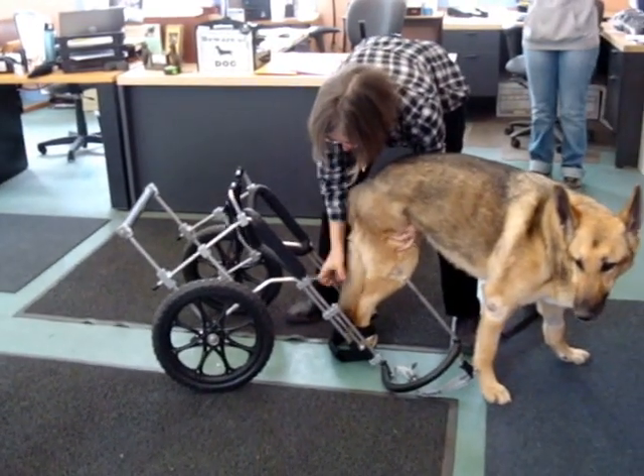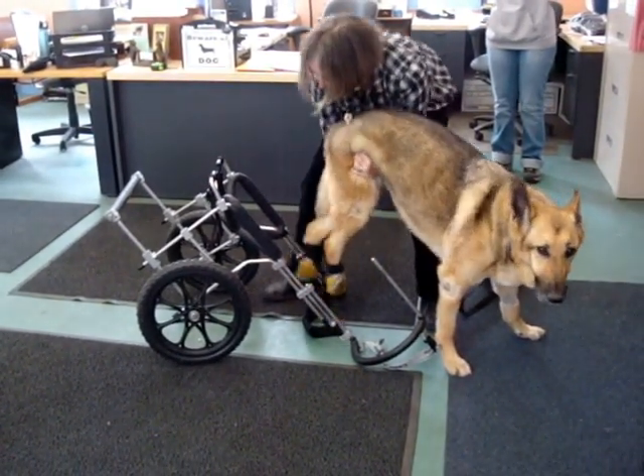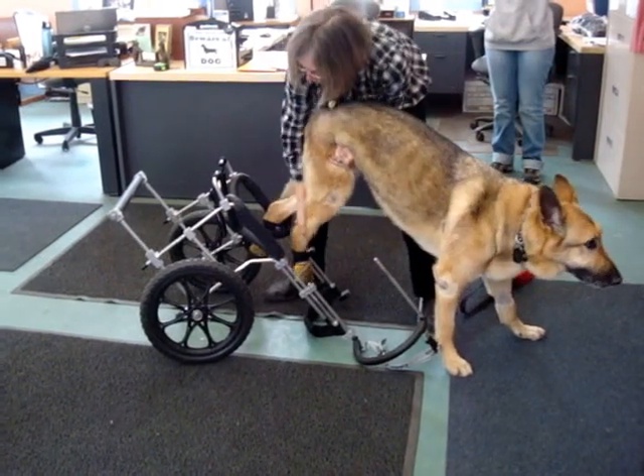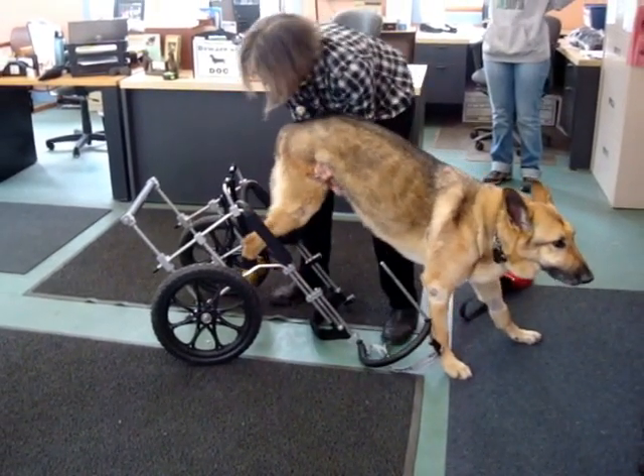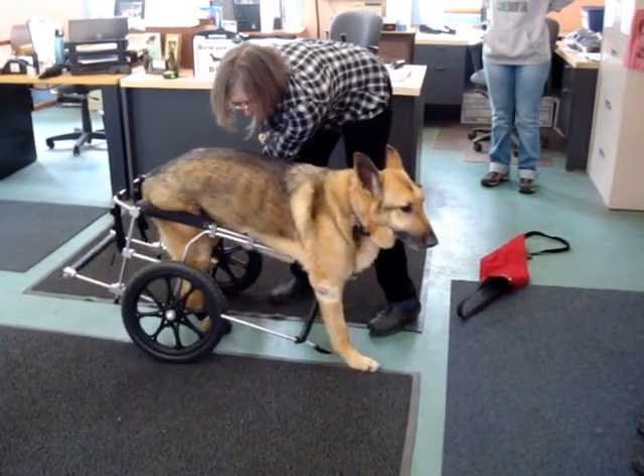So this is only the second time Rebo's been put in the cart, and this is a neutral, balanced cart, so the lift is a little steep. Put one leg in, put the other leg in, push to the back, make sure your knees are down, pull the cart up underneath.